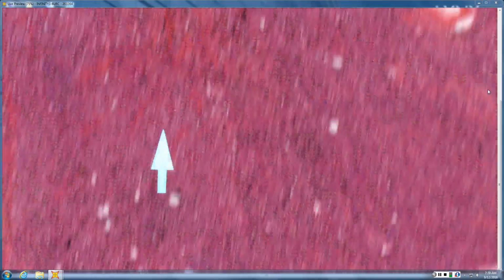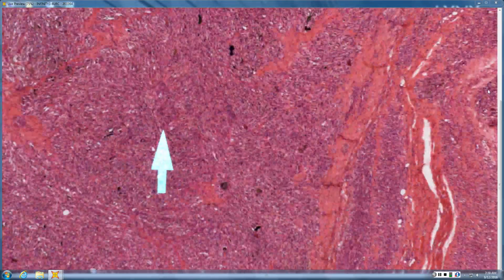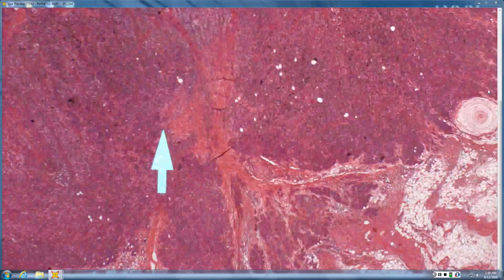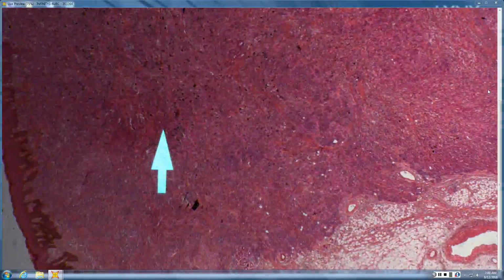Also, when you look at the stroma, blue nevus produces its own non-refractile stroma, and melanomas tend to trap pre-existing dermal collagen. So one of the things you can do is the poor man's polarization. Look at the polarization in the middle and then away from the tumor at the edge. It's kind of the same in this one, right? Mm-hmm. Whereas a blue nevus is all dark in the middle.